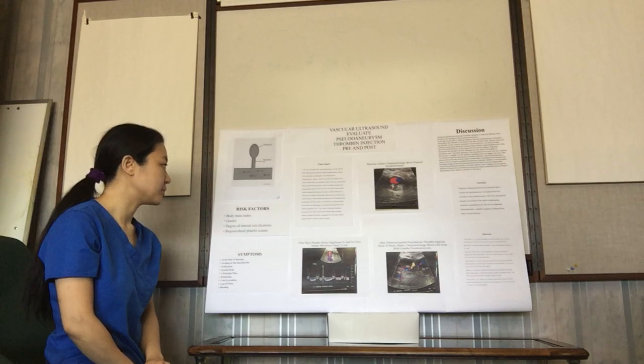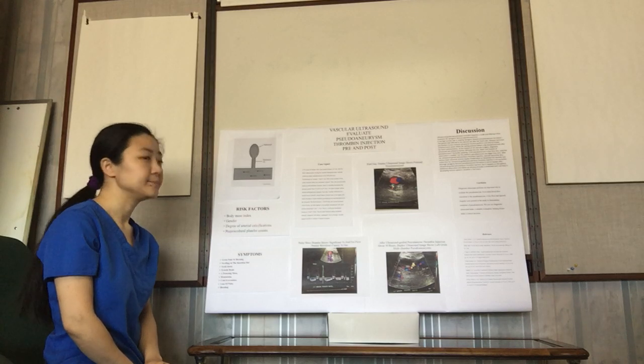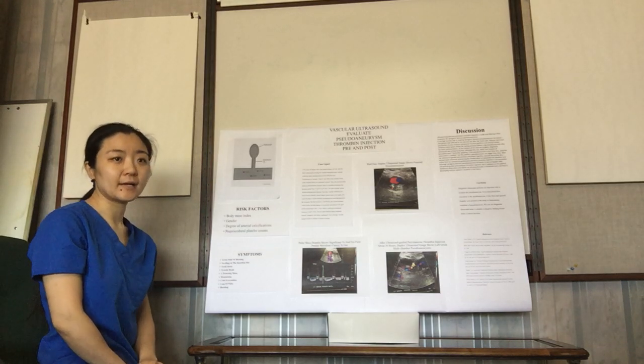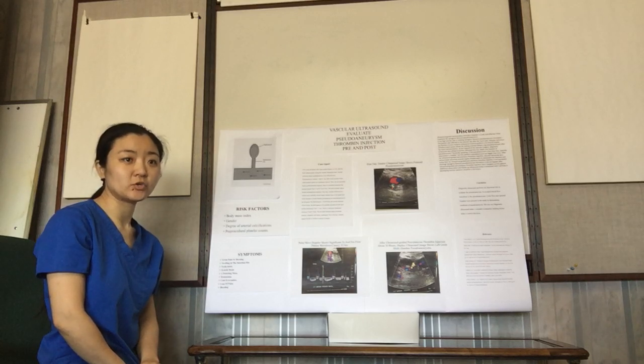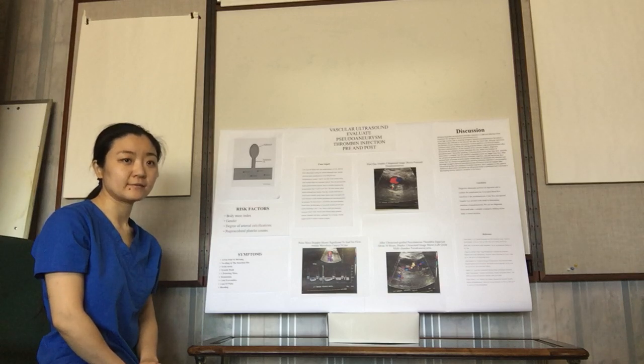There is a left groin hematoma measuring 2.2 centimeters times 4 centimeters. The ABI didn't change. Due to her age, the vascular surgeon decided to monitor her instead of doing surgery. Ultrasound-guided thrombin injection is a safe and effective initial treatment for the femoral pseudoaneurysm. It has a high success rate in treating femoral pseudoaneurysm formation.